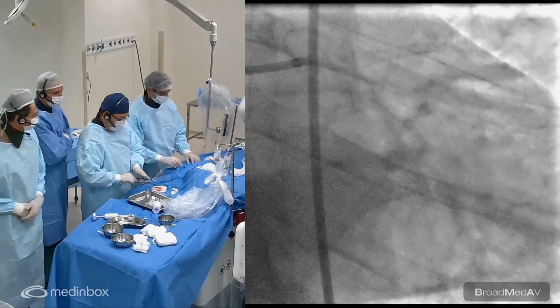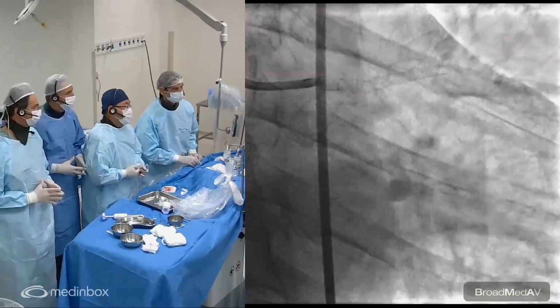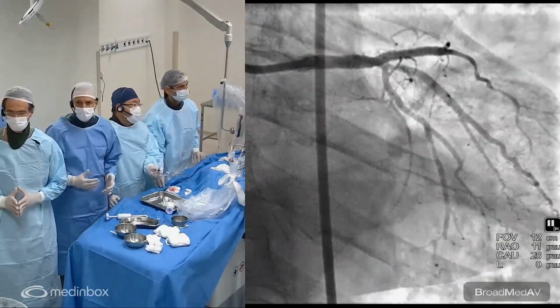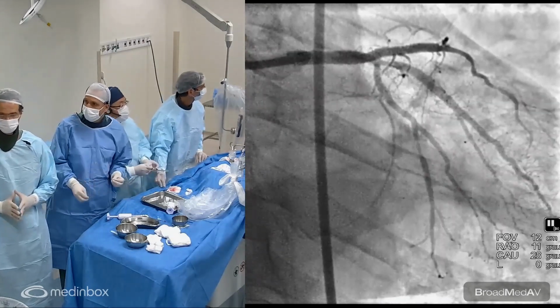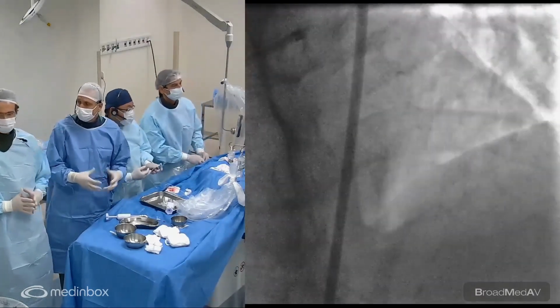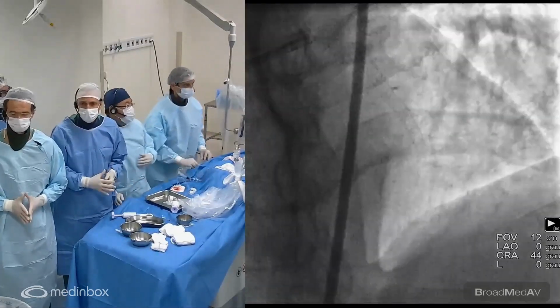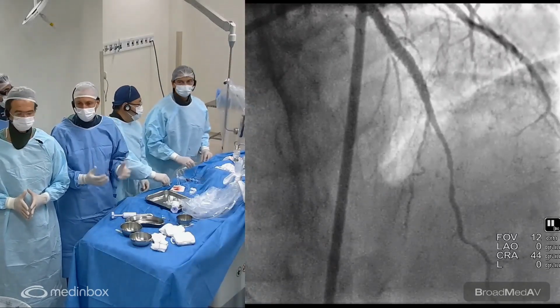Okay, great. Now you are going to the final angio. Do you understand what I asked you? Yes, and I believe you're absolutely right. With time and restored flow, remember we have a big collateral coming from the RCA, so we're still competing, and that can affect the vessel, which is spastic to some extent. You see the myocardial bridging there. So I think it could recover to the real vessel size over time.